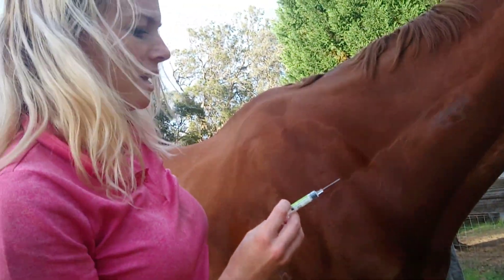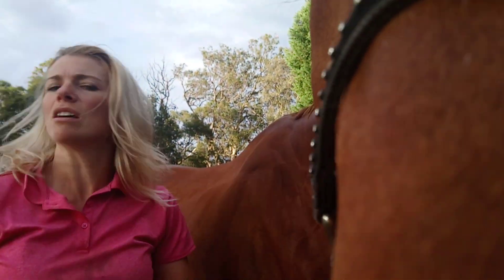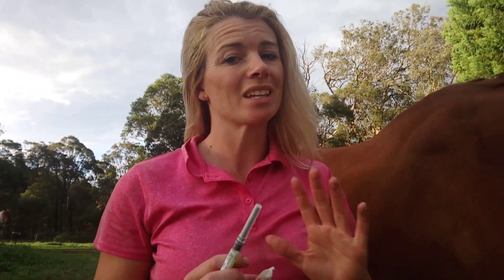And that's what there is to it. So we want to cap that syringe. And then, depending on what it is that you're administering, there'll be different potential side effects that you need to keep an eye on. So you want to read your instruction sheet for that and just keep an eye on your horse. If you notice anything untoward, don't hesitate to call your veterinarian, because you don't want to leave things that you're worried about to the point that they get big and out of control. I always would rather that you ask that question, which might seem silly, but that could potentially help your horse, than let it get to something that's big and then your horse gets sick or something bad happens. So that's it. See you again, thank you.